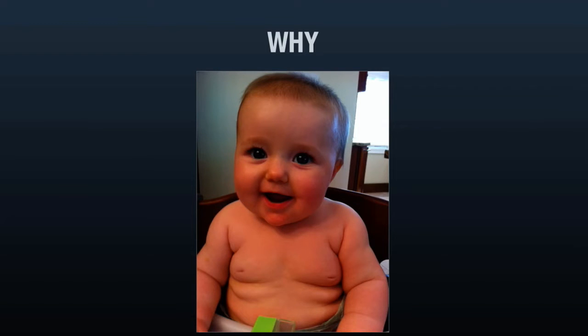This is actually my baby. This is my daughter, and the reason I'm showing her is because she's a perfect example of very difficult IV access. She's got a lot of tissue. She loves to eat. In fact, her sister, who is 2 years older than her, if she doesn't want to eat something, she frequently would just say, "Give it to Avery," because Avery will eat anything. And that's great if you're a baby, but it's not so great if you have to have an IV placed.